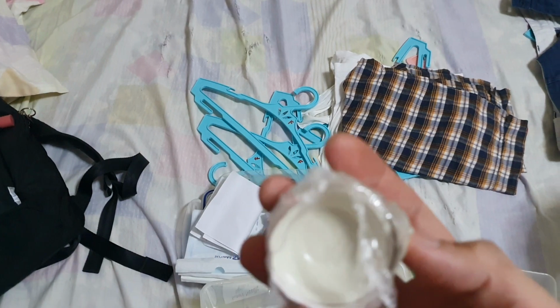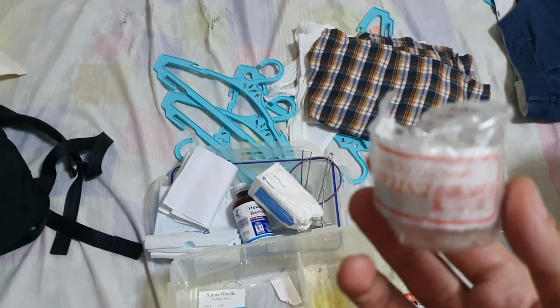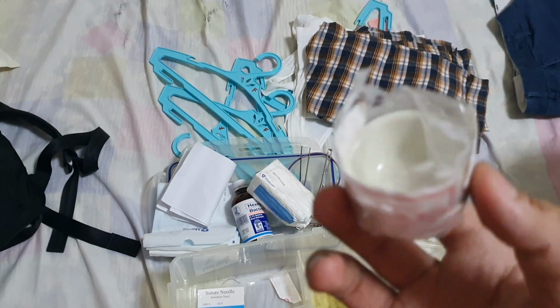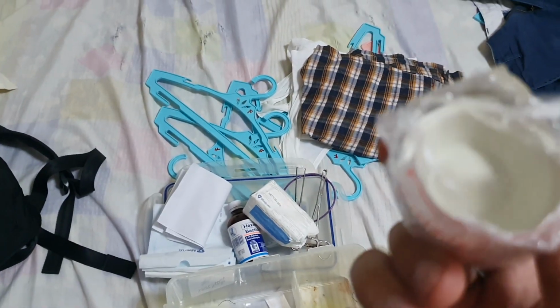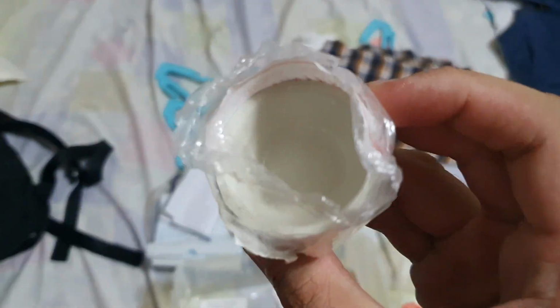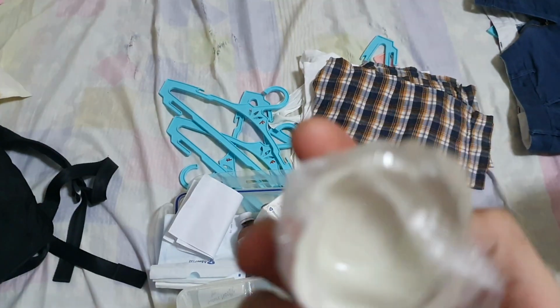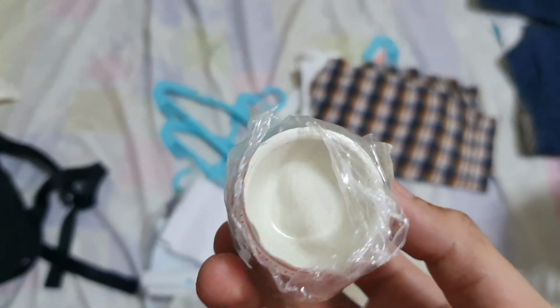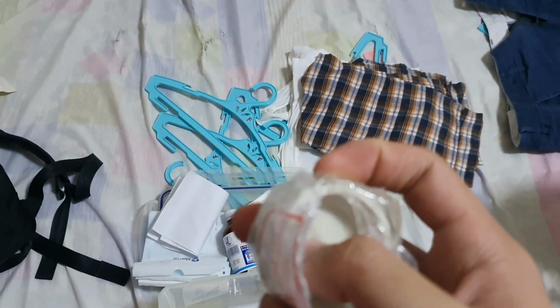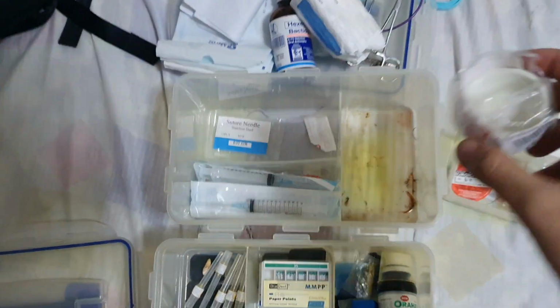This is the specimen container. I haven't done any clinics for the past 3 months. It's because of this COVID-19. It's very not safe for us to be handling patients right now. So yeah, this is the specimen container. After we do the extraction, we're going to put the tooth here into the specimen container.